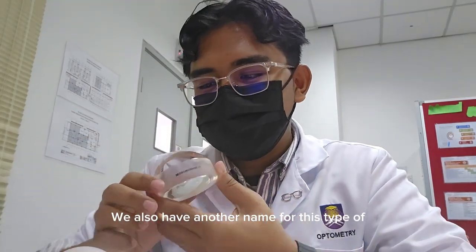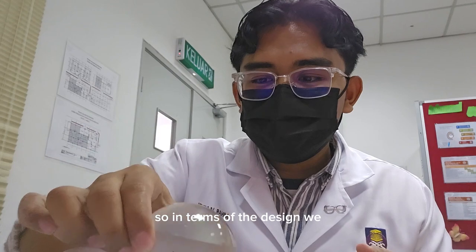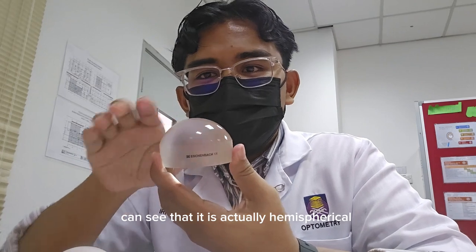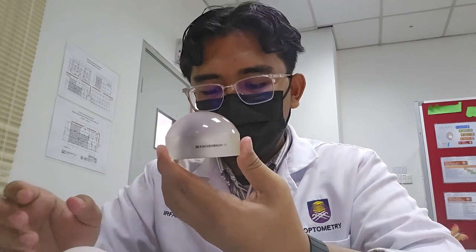We also have another name for this type of dome magnifier, which is the paperweight magnifier, because of its heavy attributes. In terms of the design, we can see that it is actually hemispherical. Another type is hemicylindrical, which is the bar magnifier.